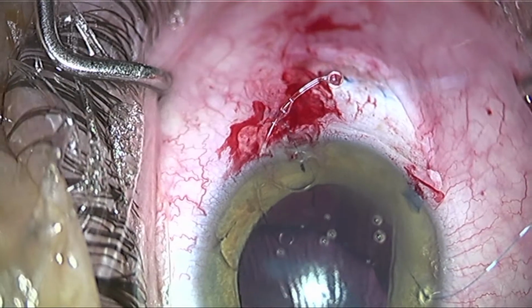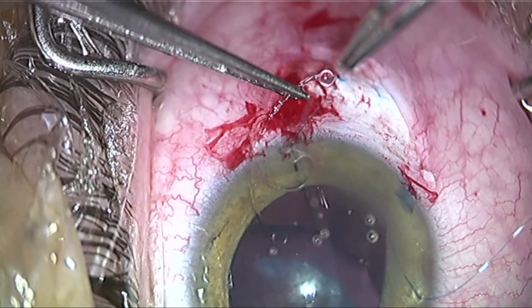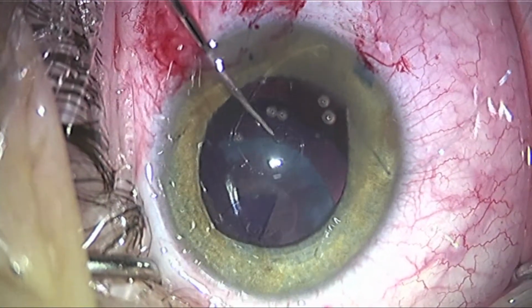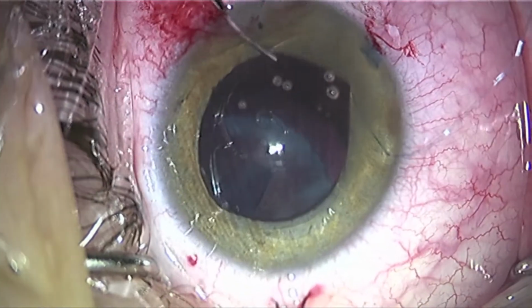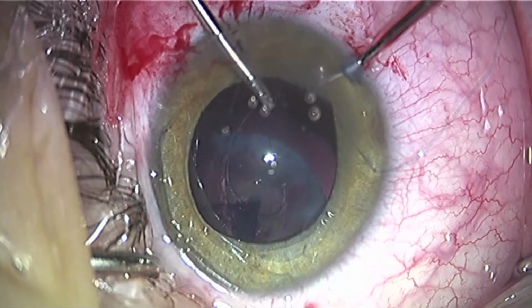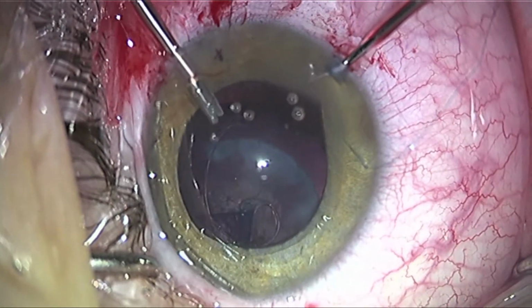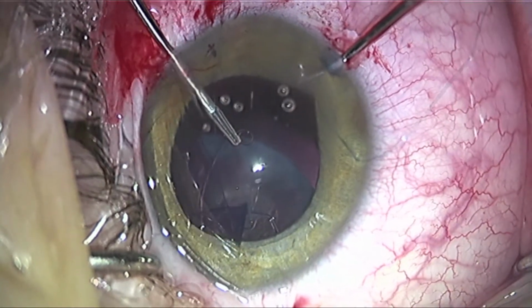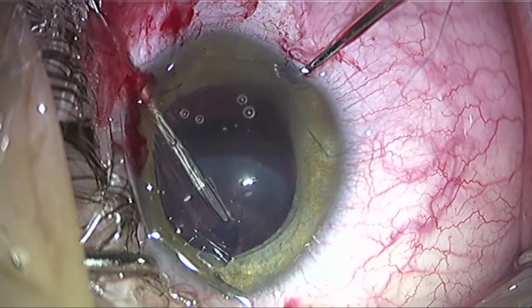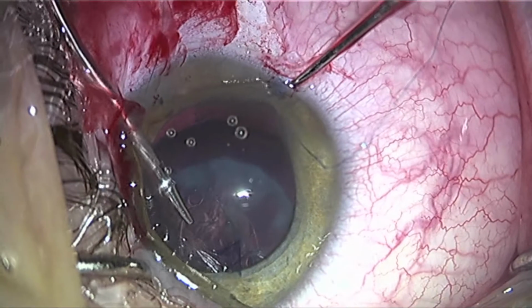This requires about a 2.8 millimeter incision, and you can just place the segment into the eye. If you remember, we don't have a complete capsulorhexis here, so this was tricky, trying to fit this segment through this small rhexis without ruining the capsule. So we did this with a combination of Kuglen hook and these Duet micro forceps. I was able to get this Ahmed segment into the lens capsule and then bring that trailing segment underneath the edge of the rhexis.